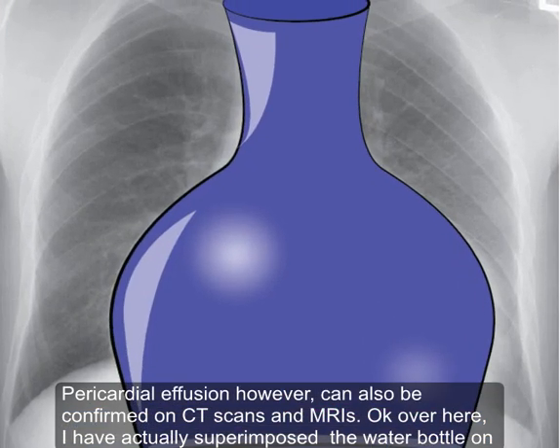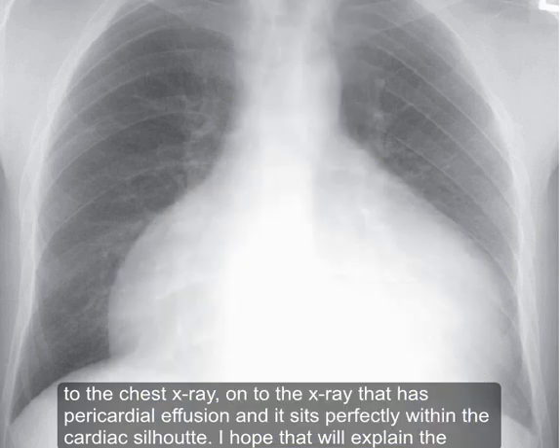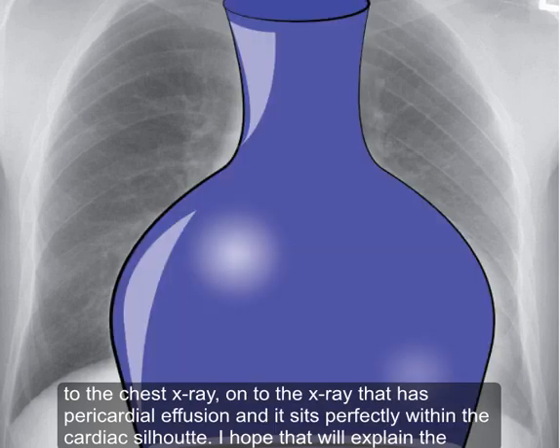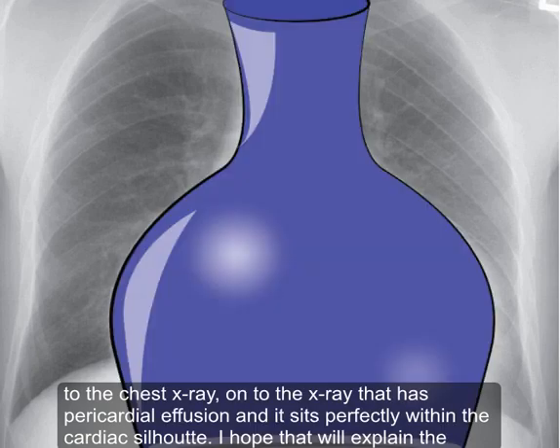Here I have actually superimposed the water bottle onto the chest X-ray that has pericardial effusion, and it sits perfectly within the cardiac silhouette. I hope that will explain the concept. Thank you very much.